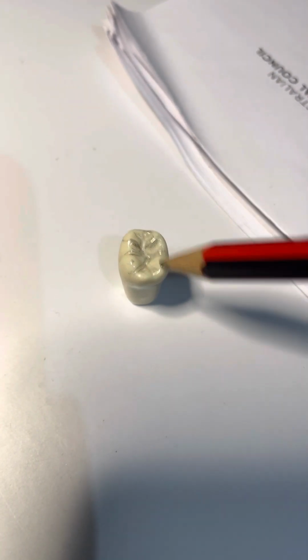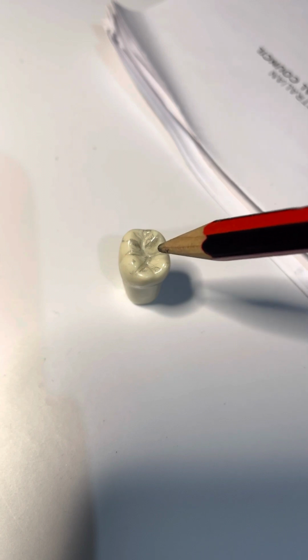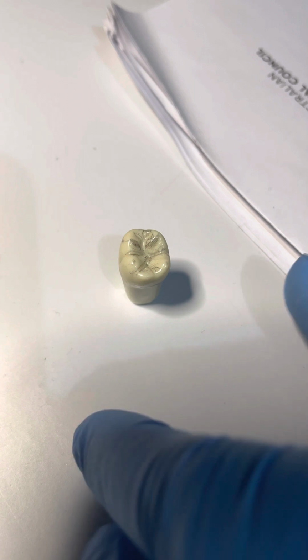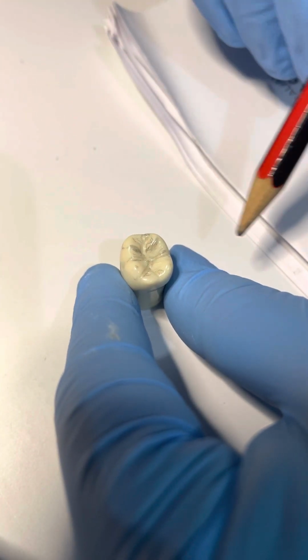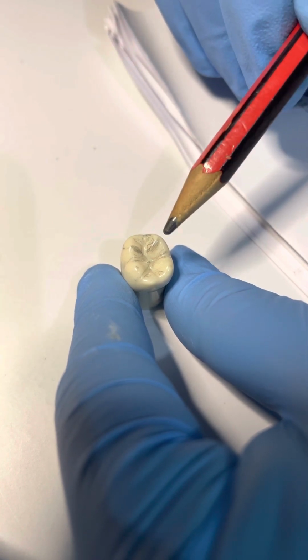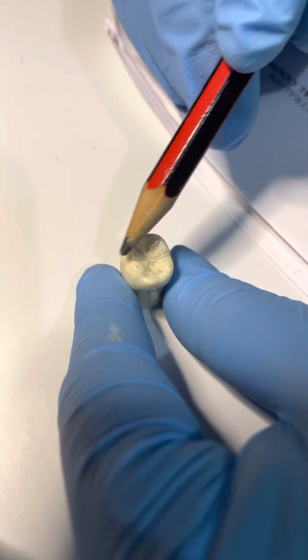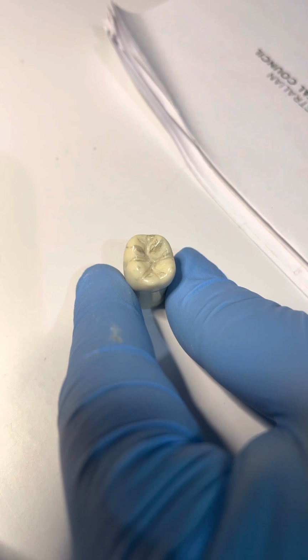So the tip of the distobuccal is actually visible. All other cusp tips are not visible, so they are overlapping one under another. When you are doing the anatomy, making the amalgam or composite, you have to make sure that the distobuccal cusp tip is showing, and all other cusp tips are not showing. They look like they are overlapping, one under another.